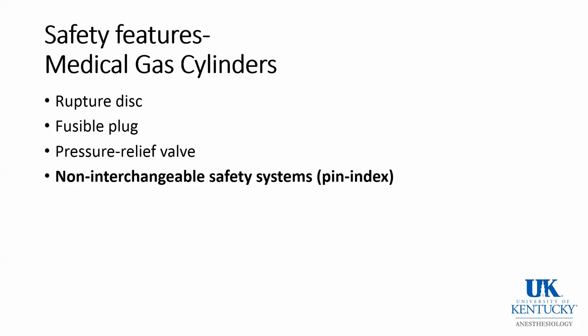So this pin index system is a safety feature that you should be aware of. The radius of 9/16 of an inch is not important.